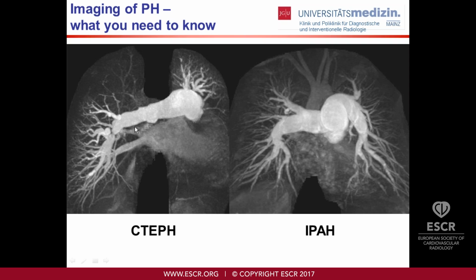Just some examples going from MR imaging. Here a patient with a chronic thromboembolic pulmonary hypertension.